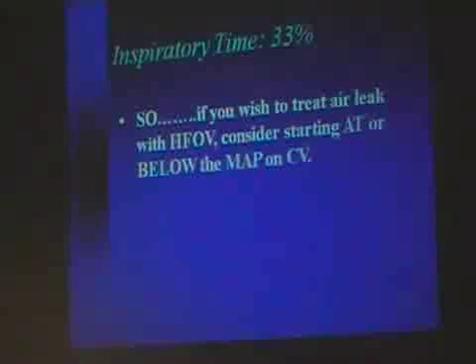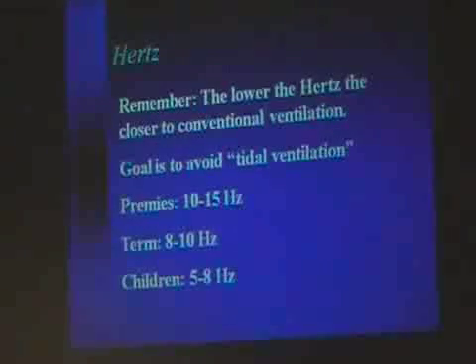So if you happen to be in London and somebody asks you to treat a kid with an oscillator with air leak, I would tend to start with a little lower mean airway pressure and see if that will help resolve the situation. Of course, the advantage is that you're not opening and closing those lungs, so it potentially can work. It certainly can work, but the jet may be a little bit more effective.